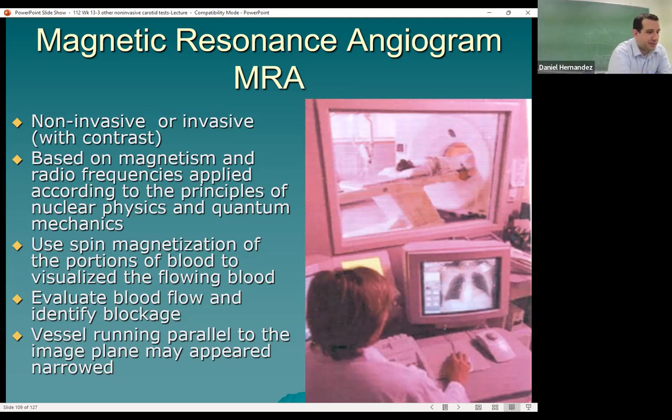So yeah, just be cognizant. Thankfully, it's not up to you guys to screen these patients. It's the MRI tech's responsibility to ensure the safety of this exam, but just recognize and be familiar with it.